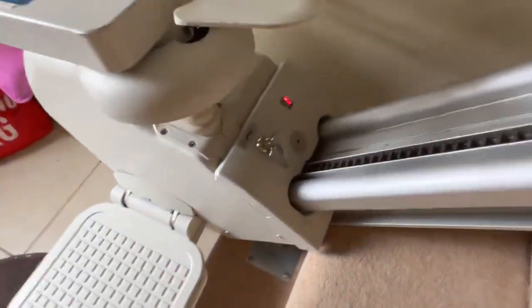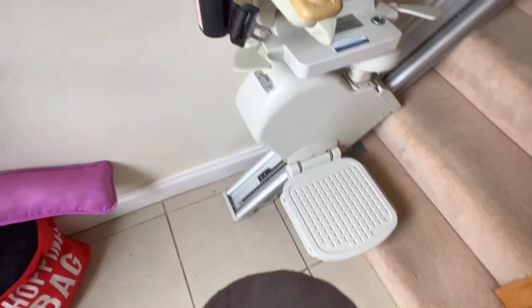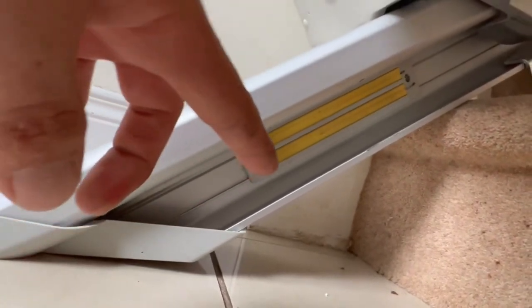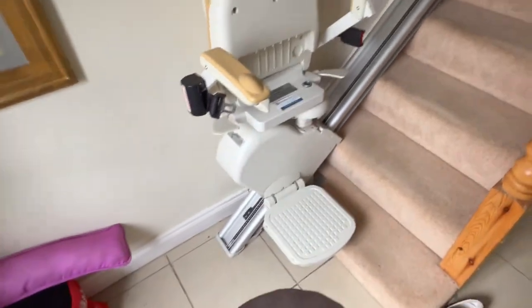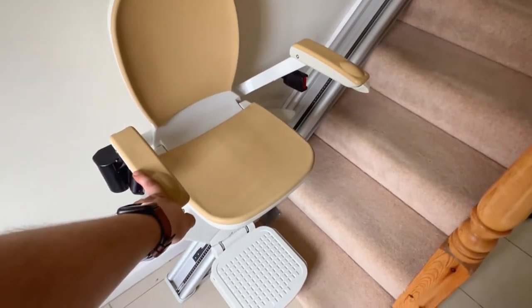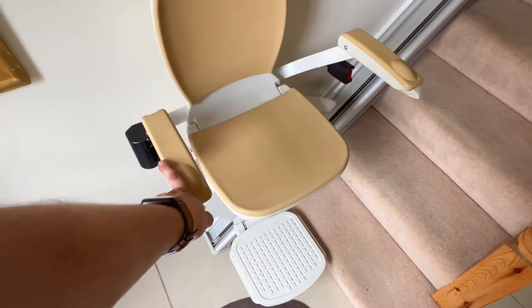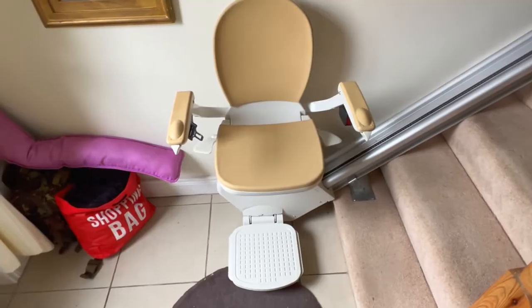You can hear it beeping — the reason it's beeping is that I'm off the charge point. The Acorn stair lift actually charges on a charge strip: that's where it charges, top and bottom. If the stair lift isn't in a charge point, it will continuously beep for about 40 seconds until it goes into something called hibernation mode, and from there it'll go to a semi-sleep state. Your batteries will go down over time if it's not put back on charge or switched off.